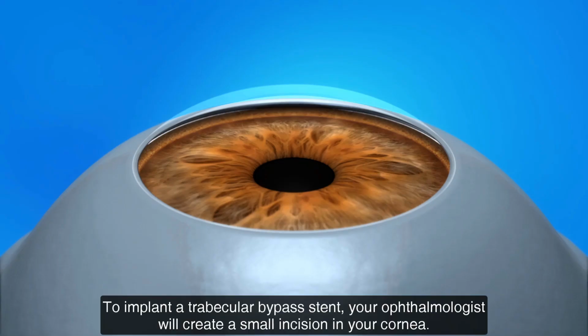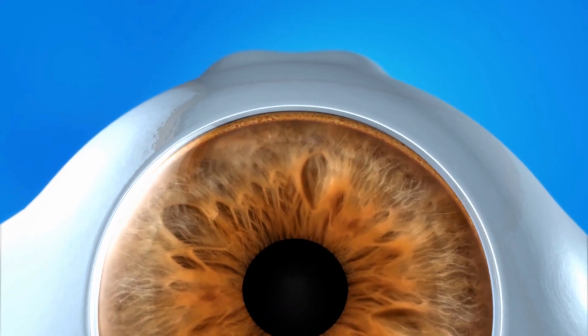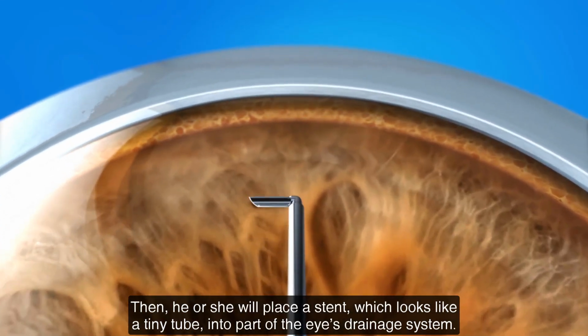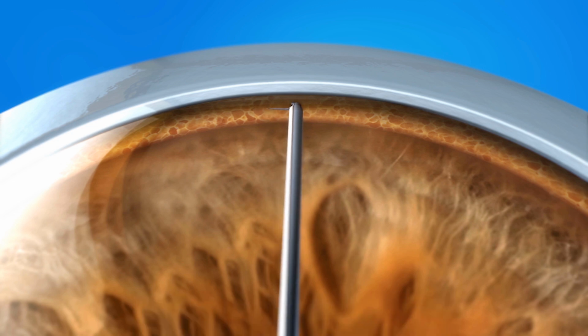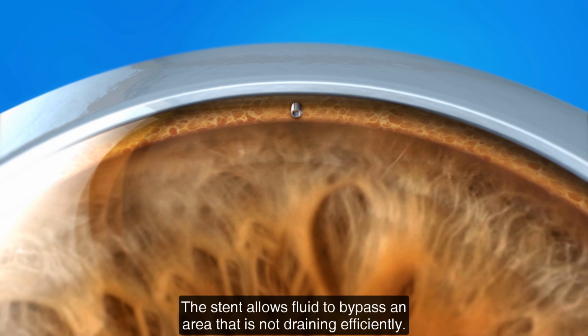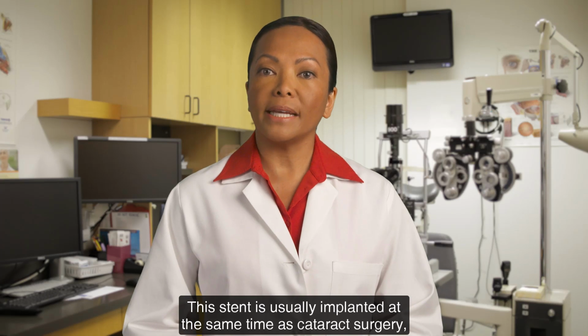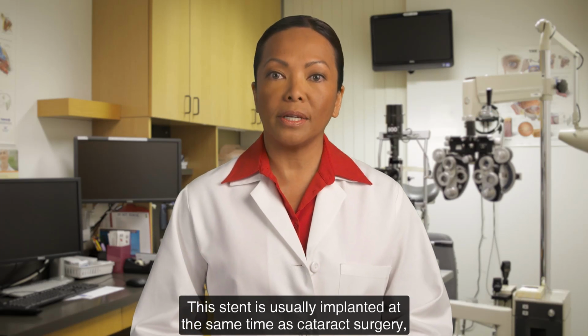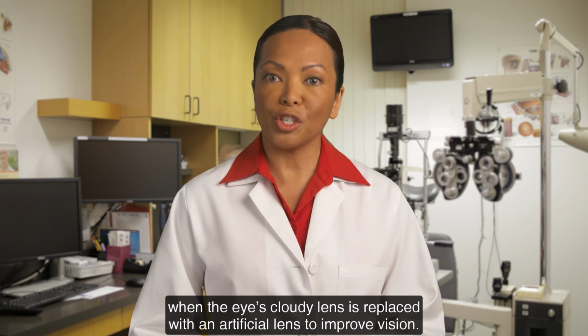To implant a trabecular bypass stent, your ophthalmologist will create a small incision in your cornea. Then he or she will place a stent, which looks like a tiny tube, into part of the eye's drainage system. The stent allows fluid to bypass an area that is not draining efficiently. This reduces eye pressure. This stent is usually implanted at the same time as cataract surgery, when the eye's cloudy lens is replaced with an artificial lens to improve vision.